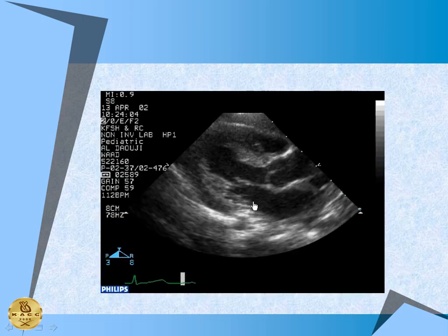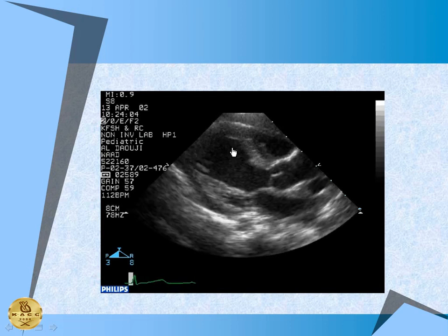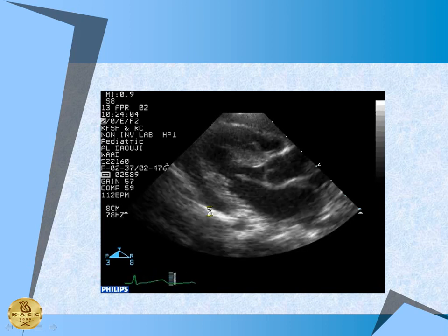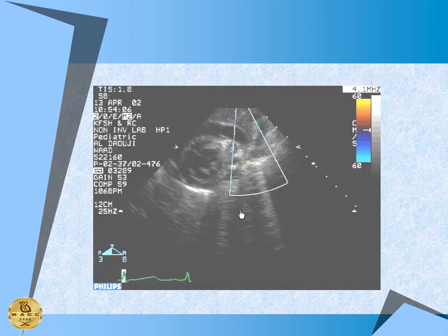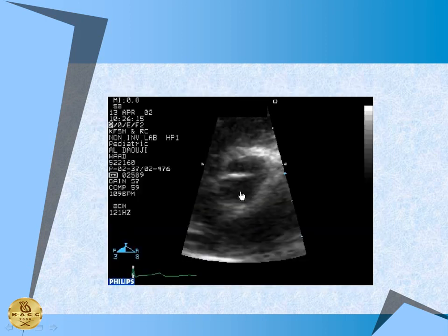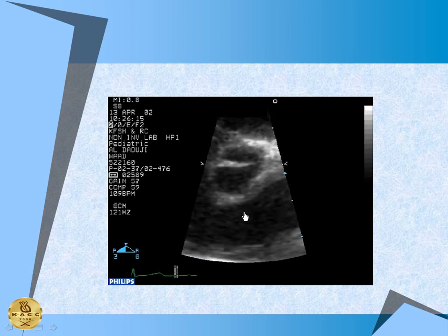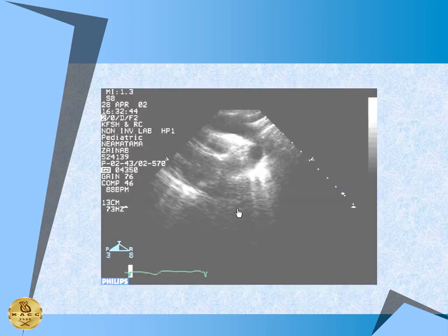I just want to show one thing more. The LVH is very important to assess, and also if the ventricle function is good in these patients. Tight coarctation. Bicuspid aortic valve, see the fish mouth? How is it opening? It's 2 leaflets again, only.